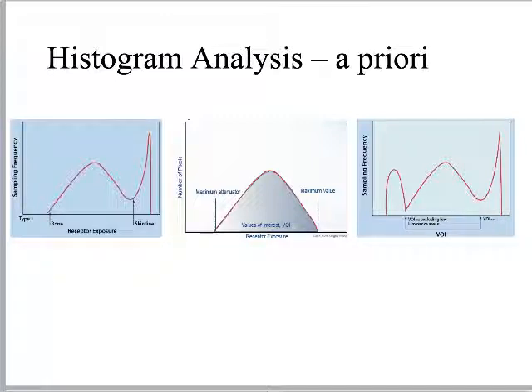Start with this picture right here. It's a great illustration. If we're thinking back to planning out how to make a pretty picture out of this, on the left-hand side where it says S minimum, what would we expect those pixels to be? What colors are they represented on the image? The white stuff, that's correct. So they're represented as minimum. There were minimum amounts of exposure there, so it showed up white, right?